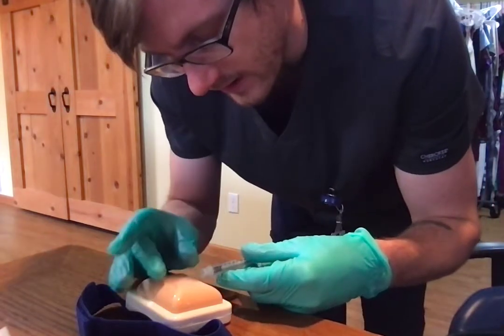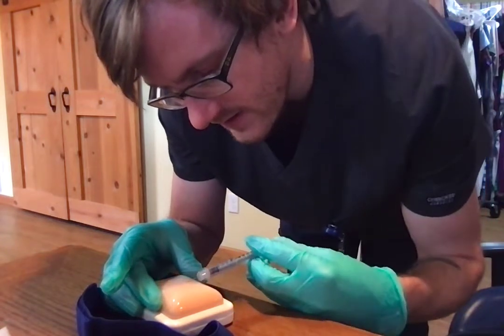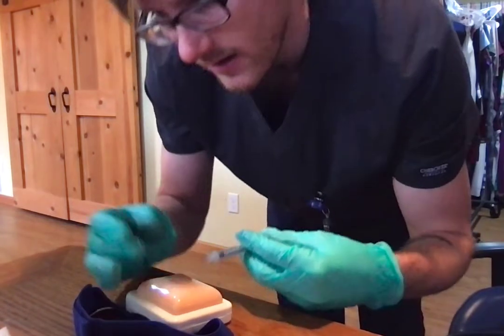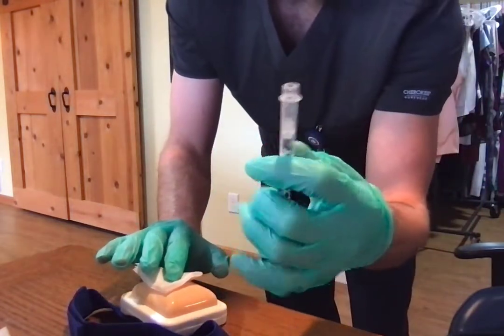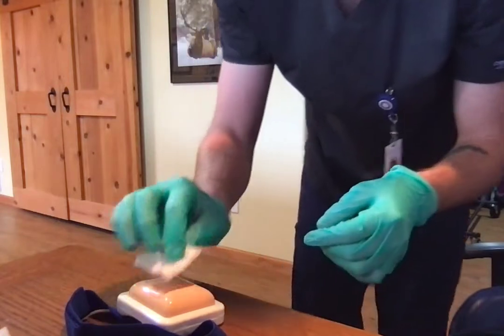So we'll go ahead and make our C shape and do our bevel facing up and at 15 degrees, and I'm going to administer this medication here. Okay, I've administered it, and I'm going to get out of there, and if there was any blood, just slightly put this cotton on there and cap my needle, and then dispose of this into a sharps container.